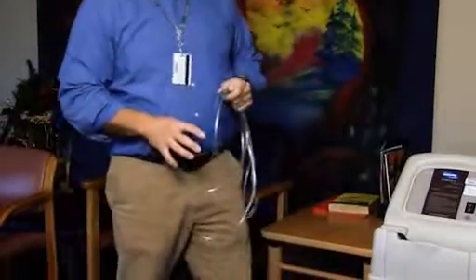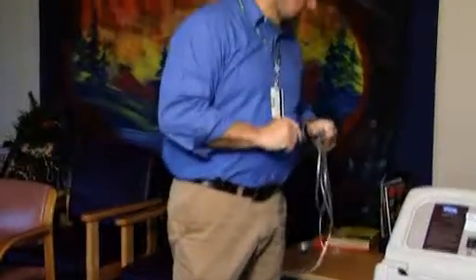And in your supply bag, and lots of times we'll hang it up on the backup tank, you should have all of those supplies. If you don't have the supplies, you call our 1-800 number, tell them who you are, and we'll get it delivered or mail it to you.